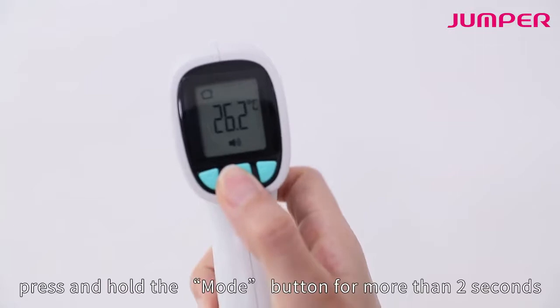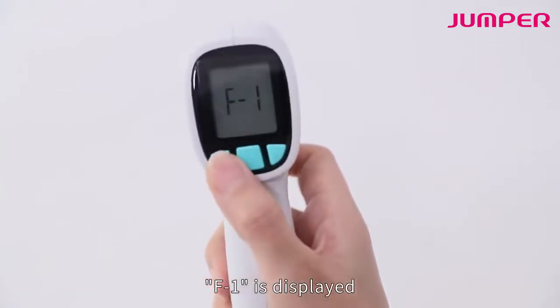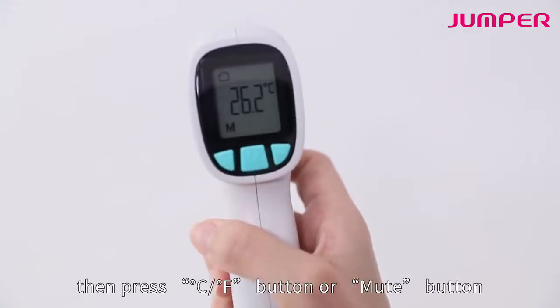In the power-on state, press and hold the mode button for more than two seconds. F1 is displayed. Then press the CF button or mute button to check the records.